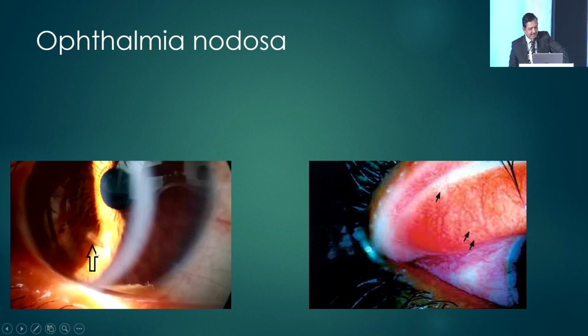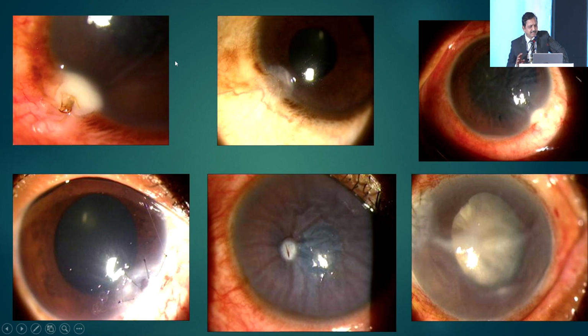It can appear like this, or sometimes there are superficial superior corneal abrasions where the foreign body lies on the lid. You have to evert the lid, and it was beautifully shown by Dr. Aniket, who removed a lot of those things. Sometimes bees, the Hymenoptera group of organisms, that is bees, wasps, and biting ants, cause problems by hitting the eye.